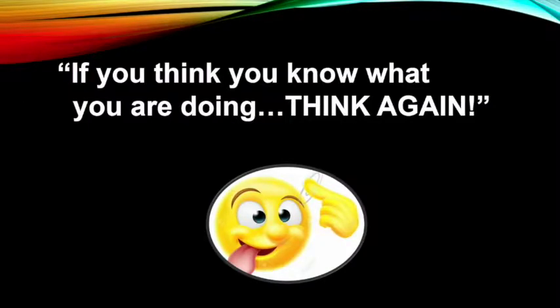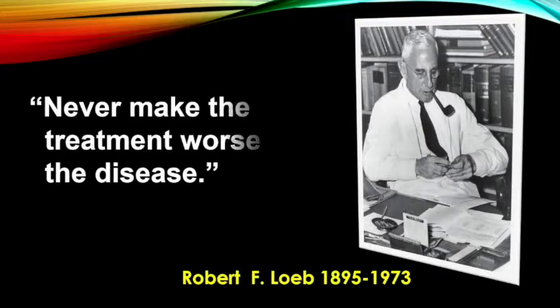Okay? I got another one. If you think you know what you're doing, think again, okay? I'm still here right now, so, all right. So this was Loeb. That's what I want to give you as a take-home message when you start looking with all your tools for these cavitations.